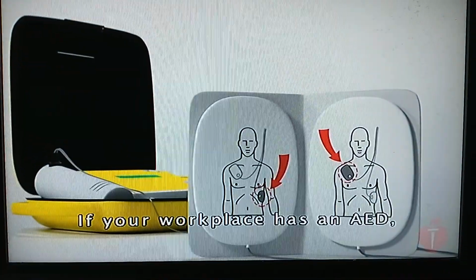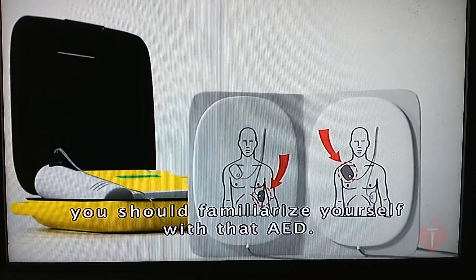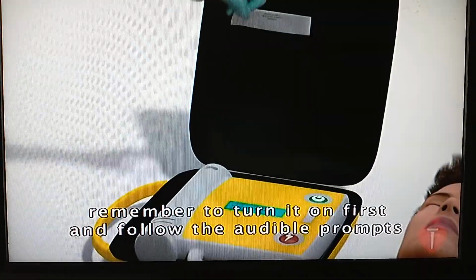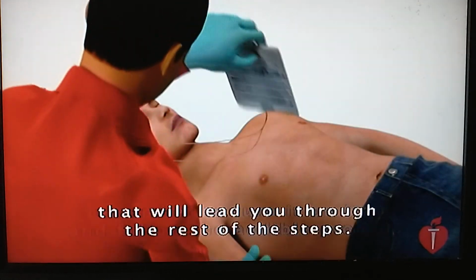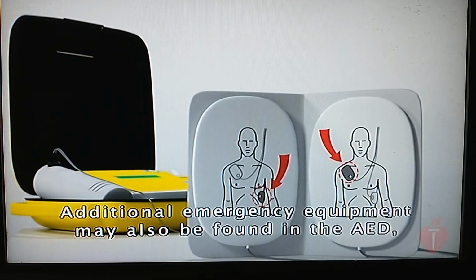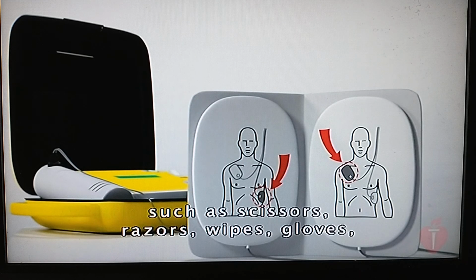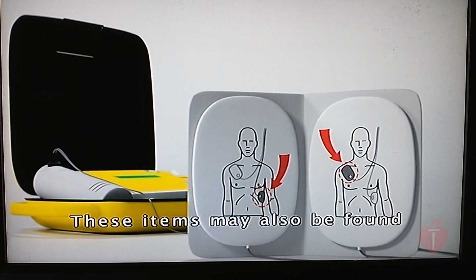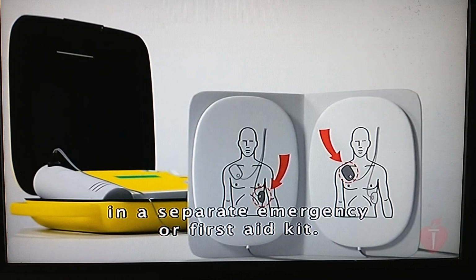If your workplace has an AED, you should familiarize yourself with that AED. Regardless of the type of AED, remember to turn it on first and follow the audible prompts that will lead you through the rest of the steps. Additional emergency equipment may also be found in the AED, such as scissors, razors, wipes, gloves, and a barrier device. These items may also be found in a separate emergency or first aid kit.